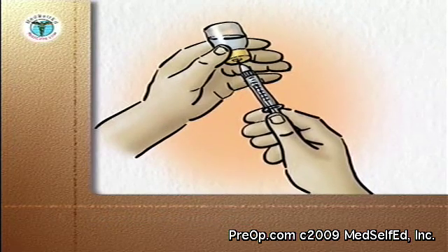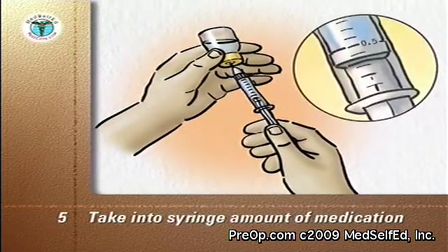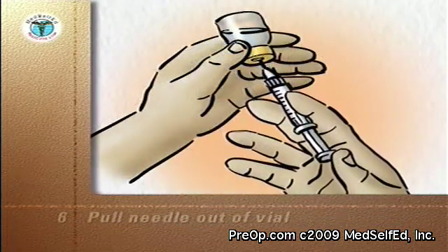Slowly pull down on the plunger to take into the syringe the amount of medication prescribed for you. Pull the needle out of the vial.